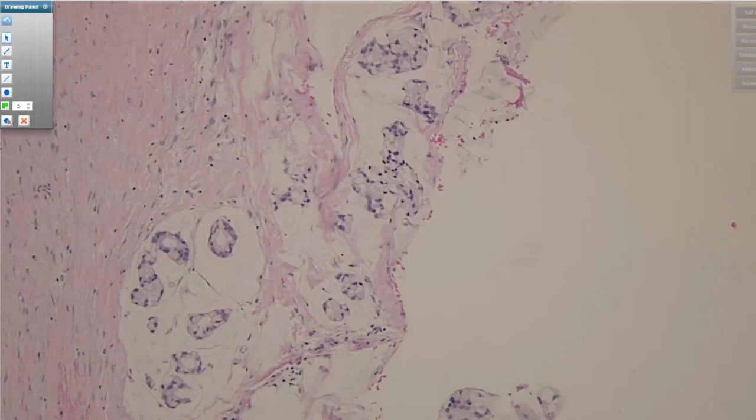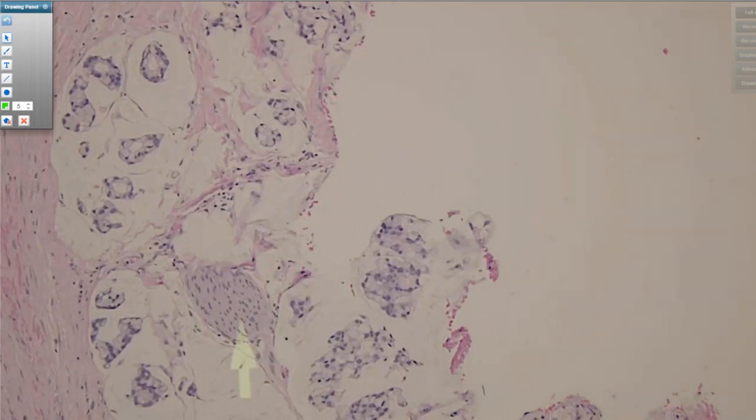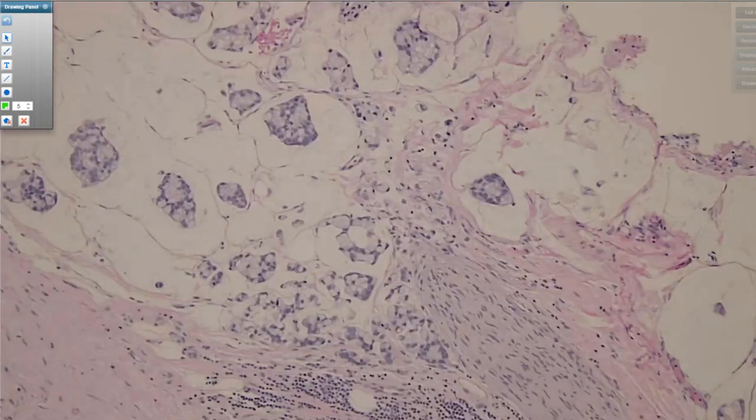See how that mucin is dissecting through the stroma and coming with it, again, around a nerve here, which you don't actually have epithelium around the nerve, but it's all very suspicious and in keeping with perineural invasion. Bumping up again here. You even have single cells here associated with it. So in these cases, you sort of have all the features you'd like to see.